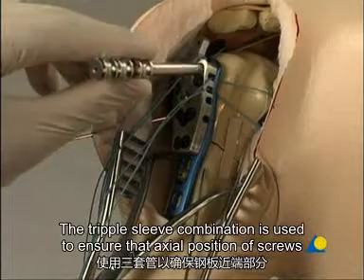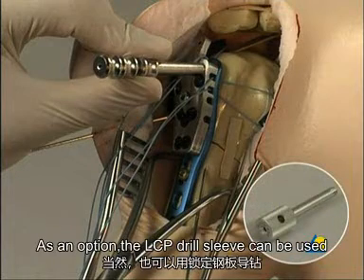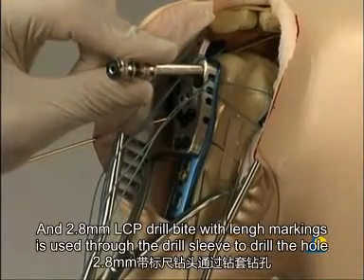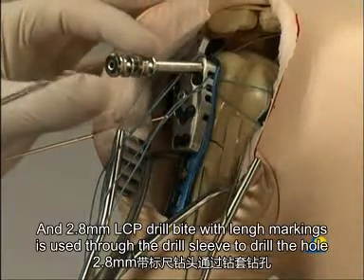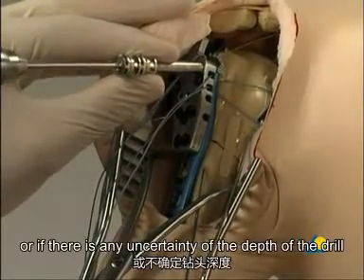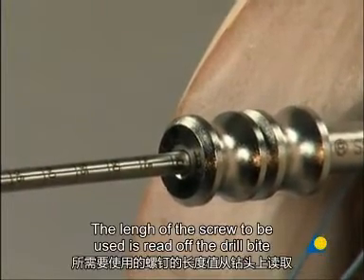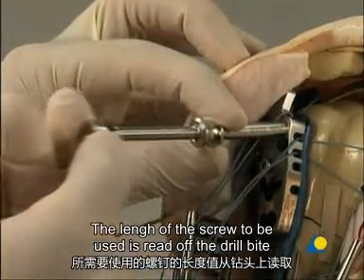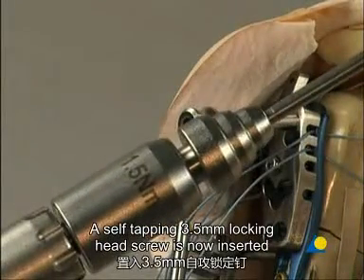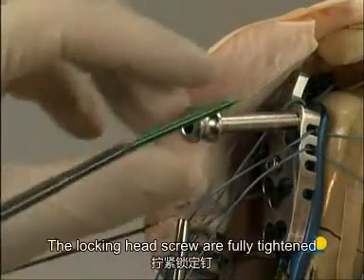The triple sleeve combination is used to ensure that the axial position of the screws in the proximal portion of the plate is correct. As an option, the LCP drill sleeve can be used. The K wire sleeve is removed, and the 2.8 mm LCP drill bit with length markings is used through the drill sleeve to drill the hole. If this drill bit is not available, or if there is any uncertainty about the depth of the drilling, it is recommended to use the depth gauge. The length of the screw is read off the drill bit, and the drill bit and drill sleeve are removed. A self-tapping 3.5 mm locking head screw is now inserted. Using the 1.5 Nm torque limiter with the screwdriver shaft, the locking head screws are fully tightened.